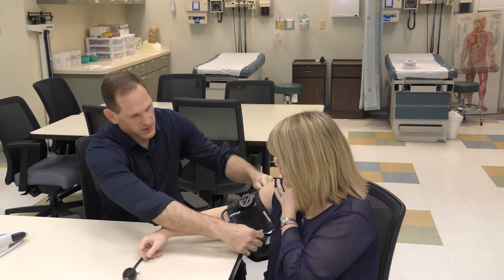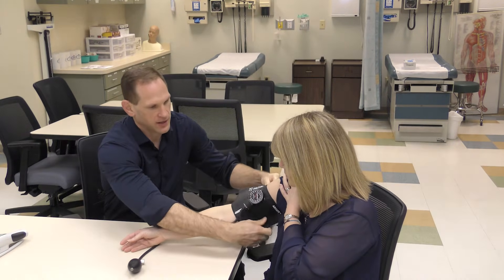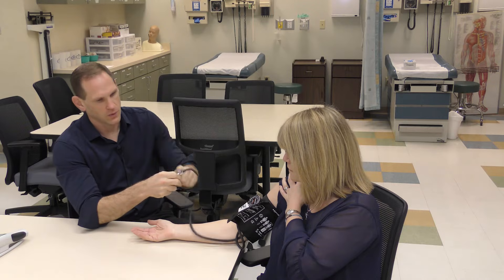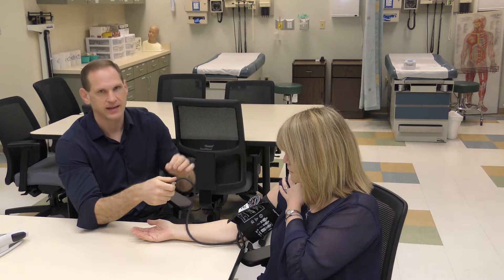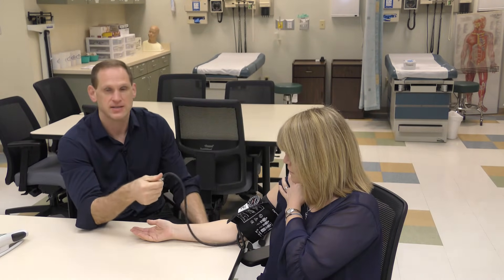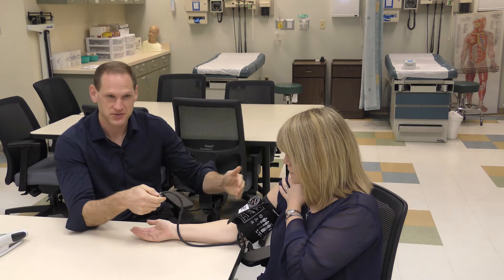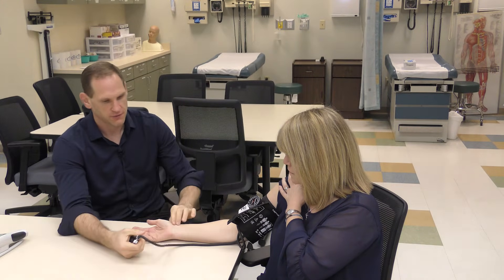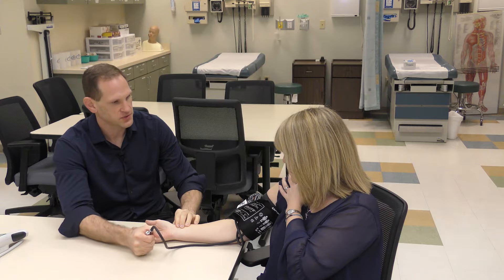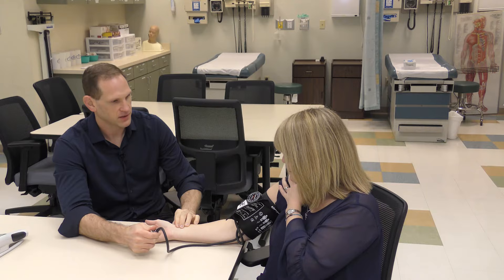We're going to place the cuff on the patient's arm. There should be an artery line, and you want it to be about midline or slightly medial to midline. With the valve — righty-tighty lefty-loosey — you want to make sure it's slightly tight, because once you pump it up it will be under pressure and not easy to loosen. Find the patient's radial pulse, pump it up until the radial pulse can't be felt anymore, and then let it out until you feel it again.